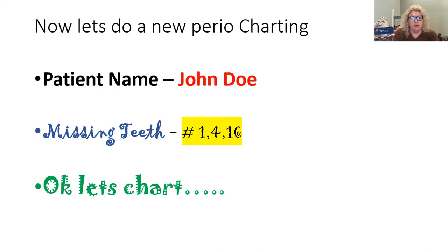So if you're not there, skip over there. Get to the mesial of number 8. Now go to that box on the lingual, mesial lingual number 8. 2, 1, 2, 2, 2, 2, 2, 2, 3, 3, 3, 3. Where am I?